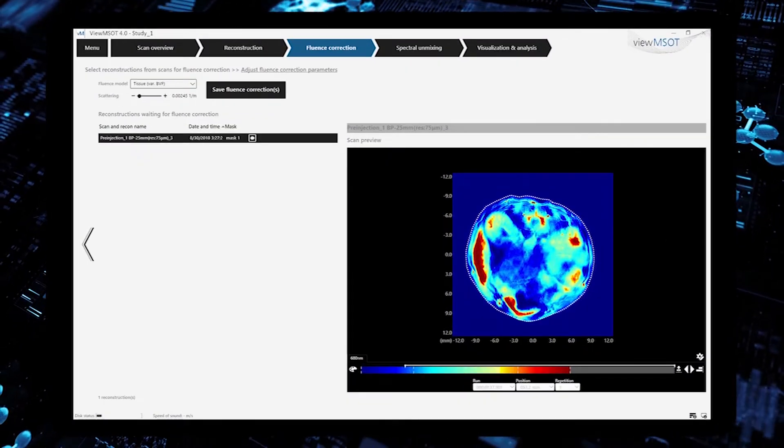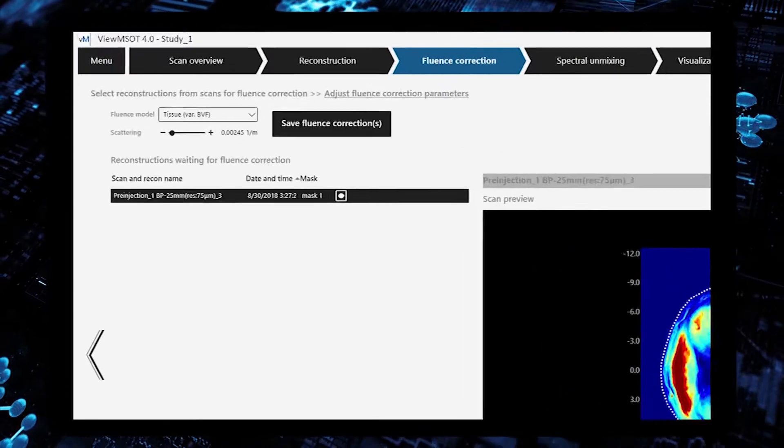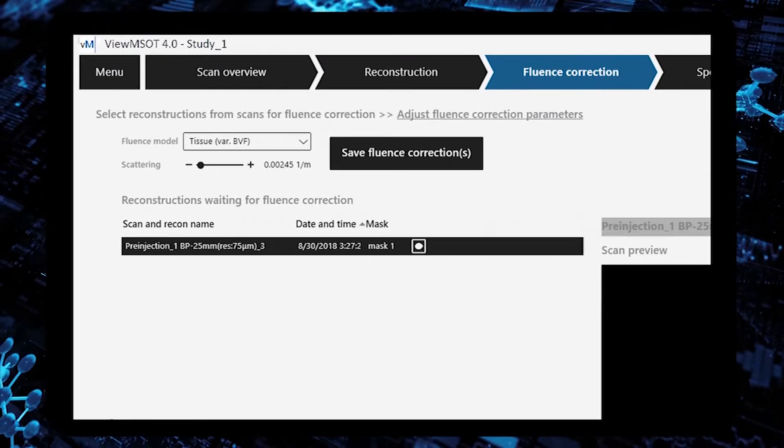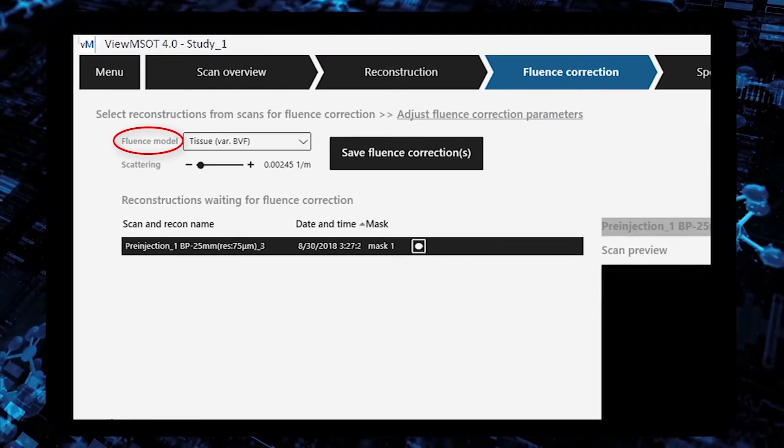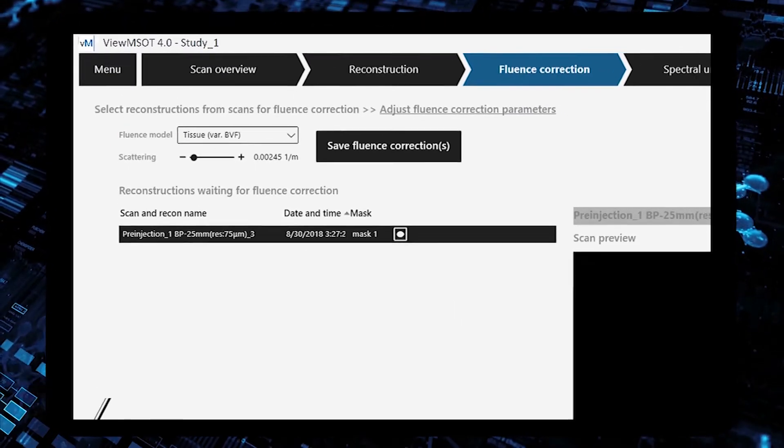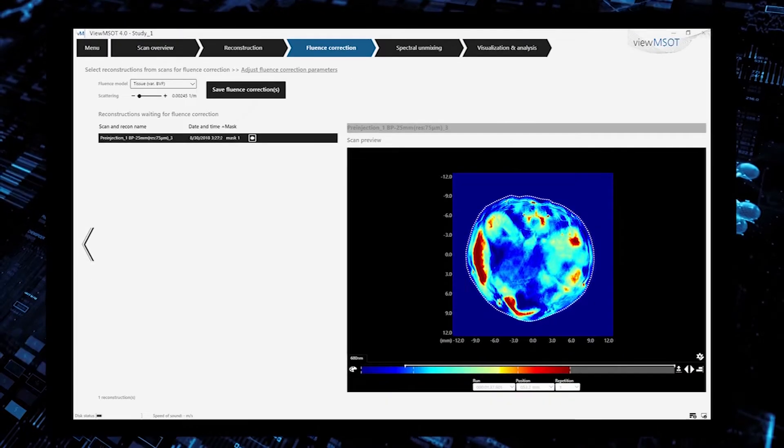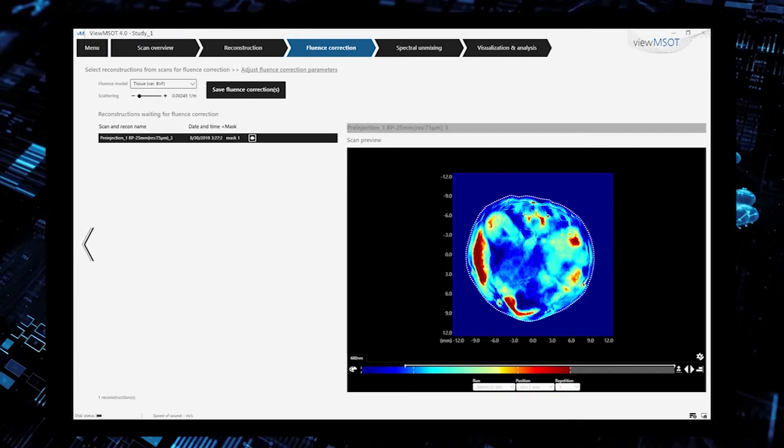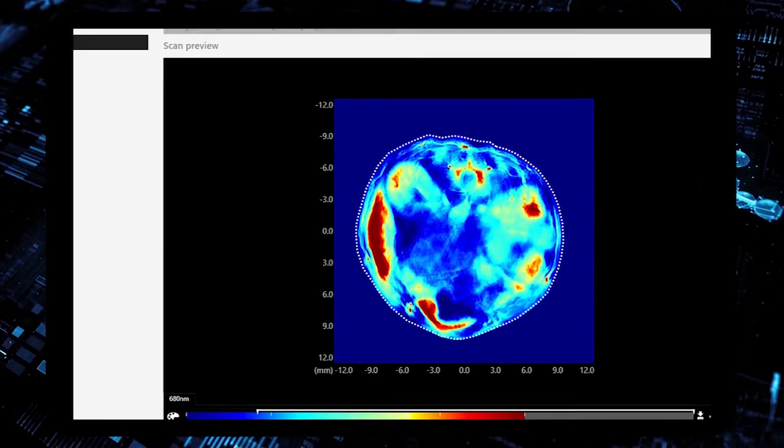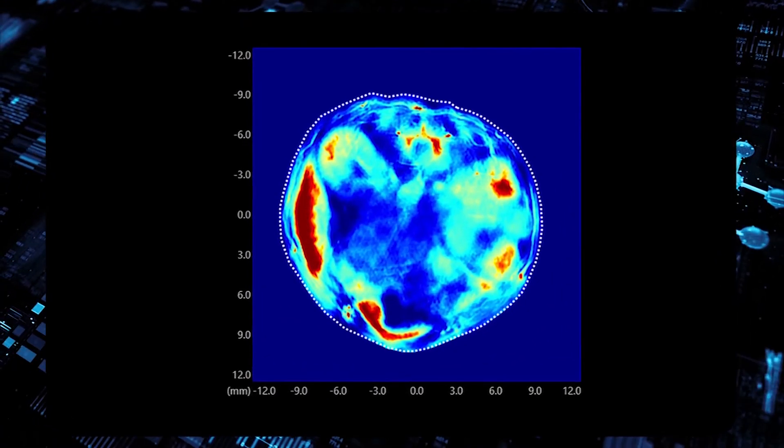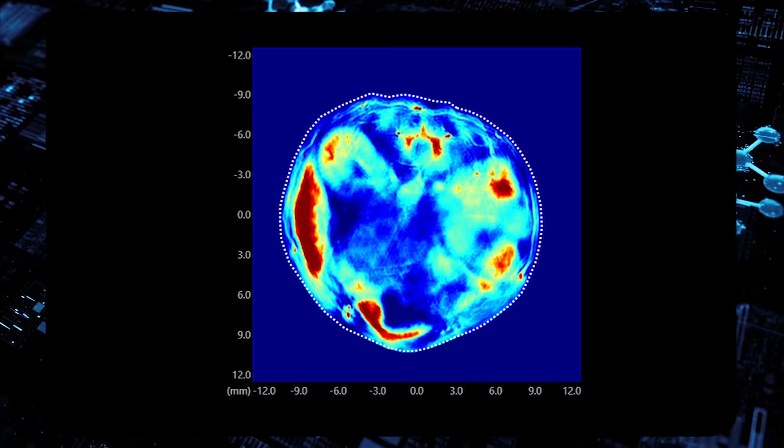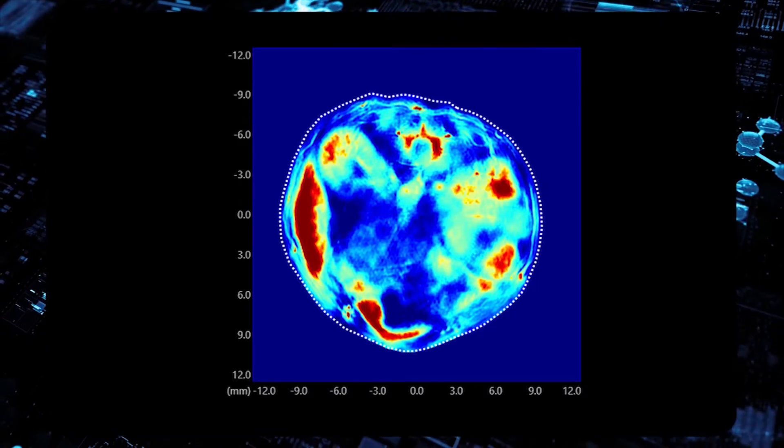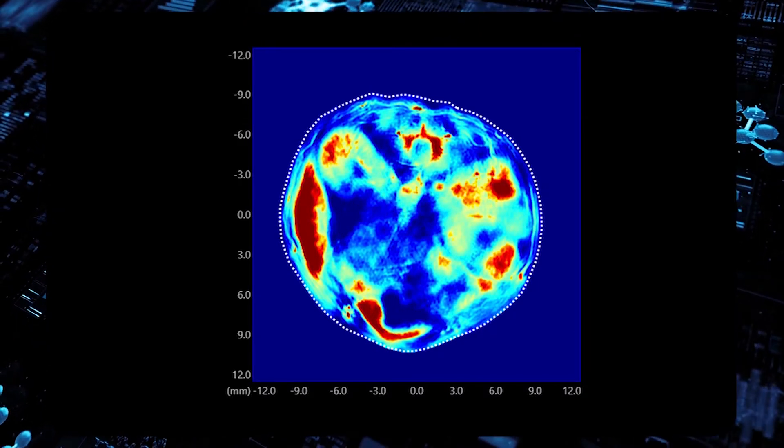The fluence correction functionality allows you to select a fluence model and adjust the tissue scattering. Following the computation, deeper lying structures are emphasized.